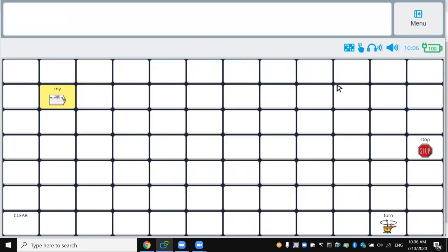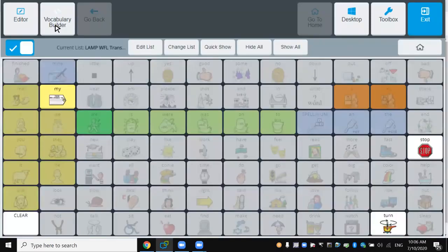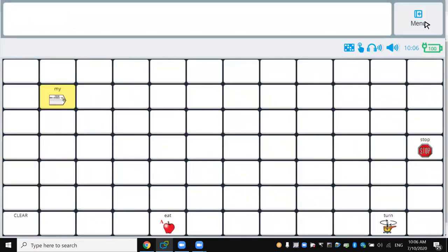The next thing they did is really added a tool for you when you don't know where the word is. The way I just did it on the fly, I'm going to call that "on the fly," I think that's what they call it too. But Vocabulary Builder, when you know where the word "eat" is, you can touch it on the fly and exit, and it works great.